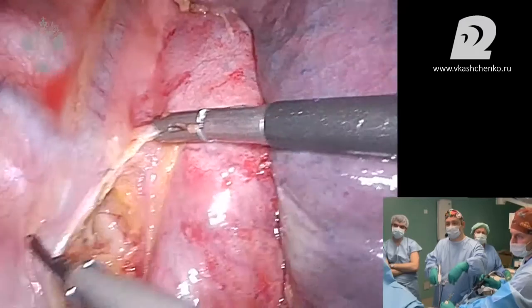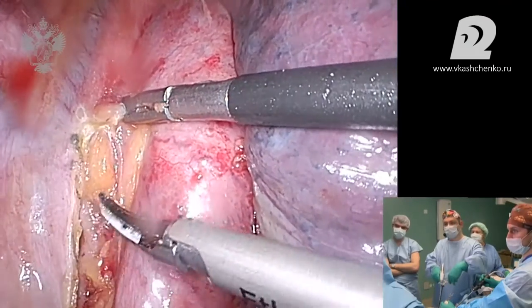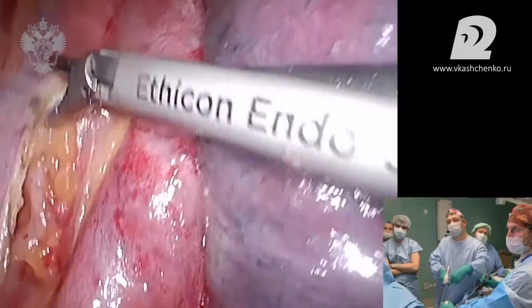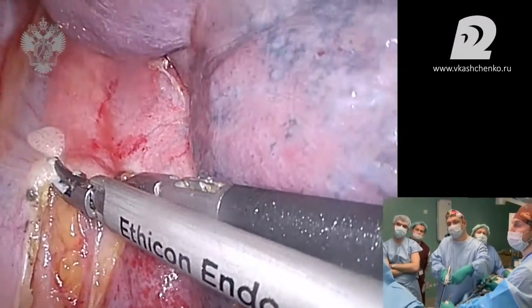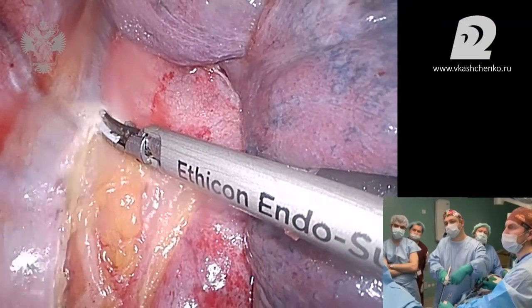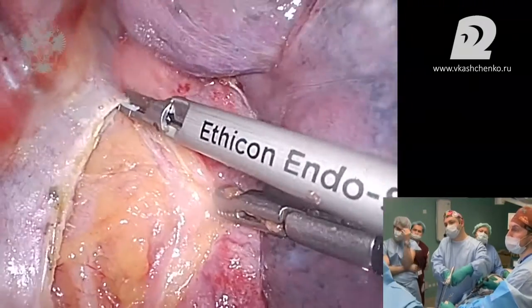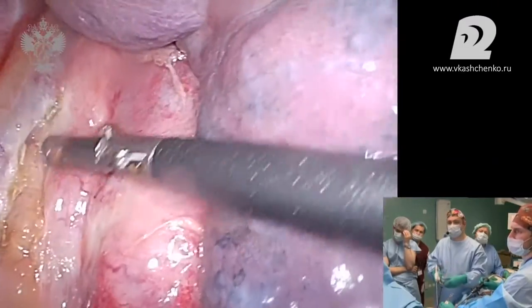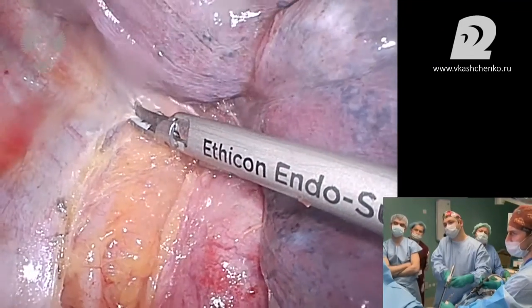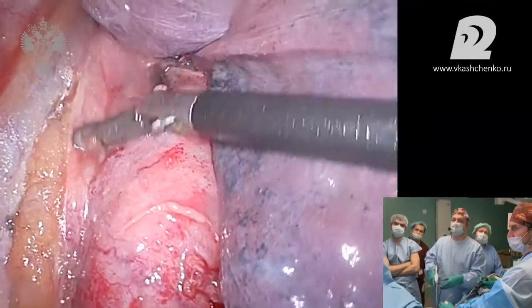As soon as there is something interesting, we'll switch to another room. This is a lymphatic chest or thoracic duct. We'll take it, we'll remove it. It will be used and studied as a sample. We cross the pleura along the azygos vein, its descending part, and there are surgeons who prefer to remove it, but it's an ultra radical story. I'm not quite sure that thoracic interventions allow to do this. We try to move as far from the tumor as possible and to be in the layer. We should be cautious with the vein. We can see it properly.